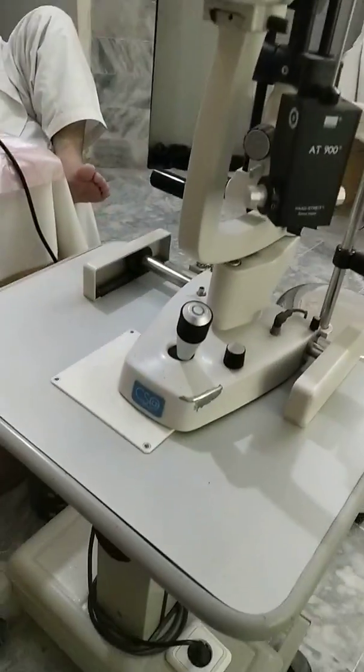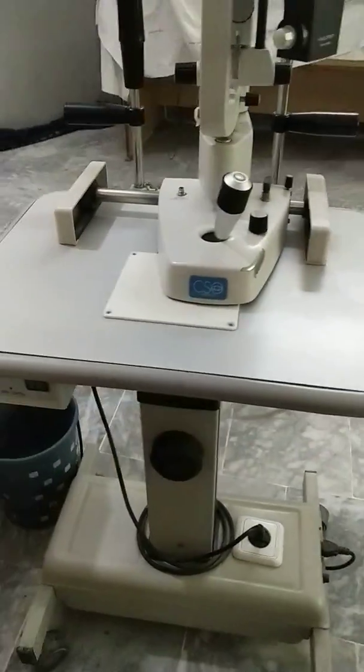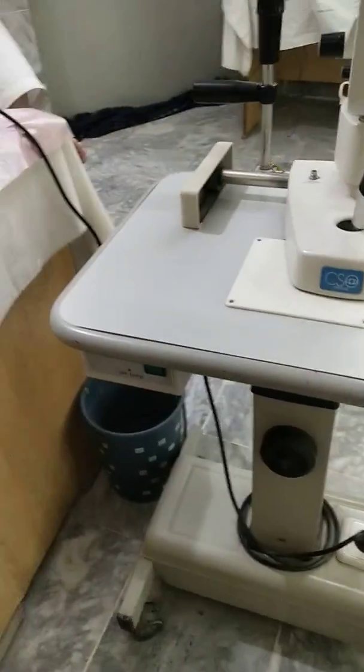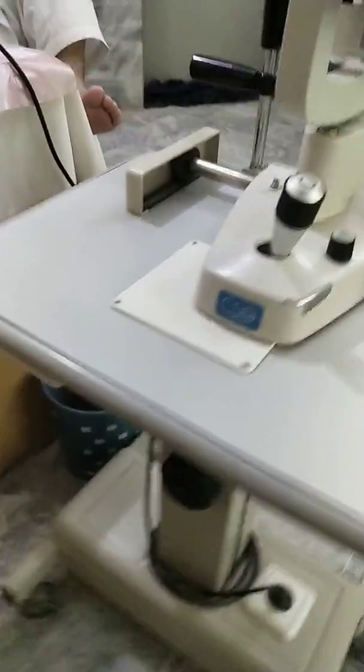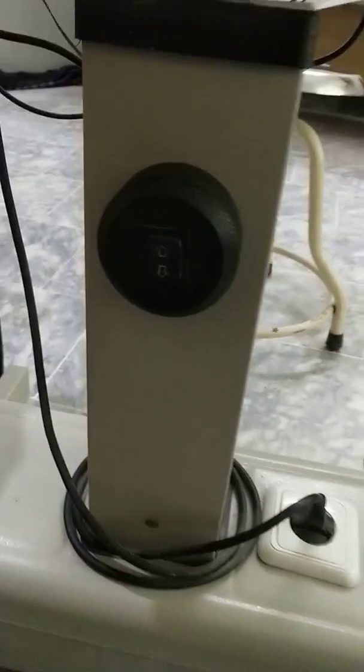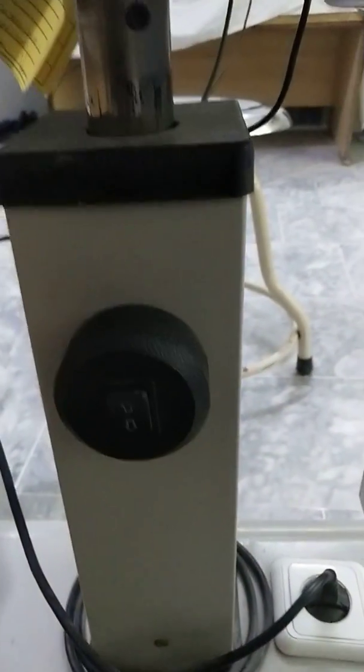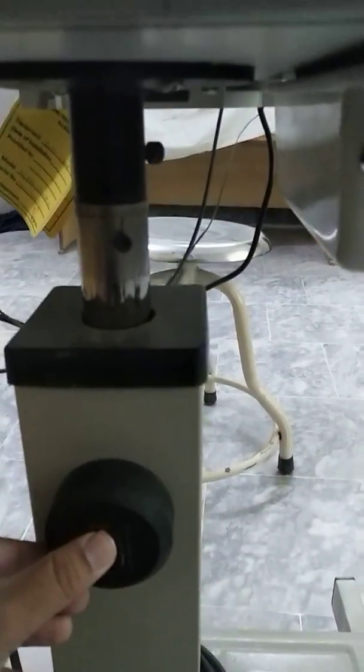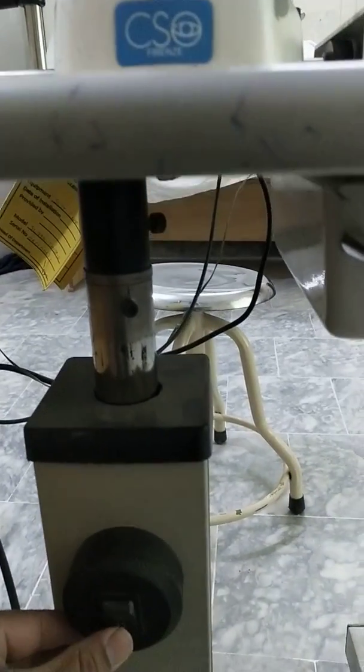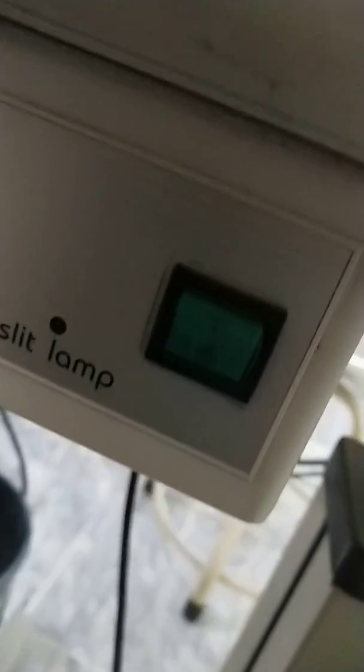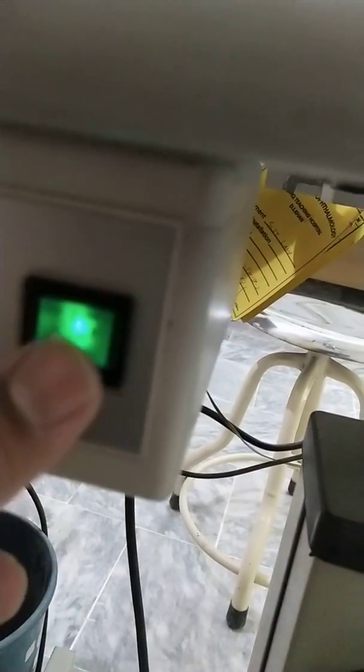This is the slit lamp. You can see this is the stand. Here it is the up and down button. Now it is moving up, now moving down. And here you can see that is the on and off button.